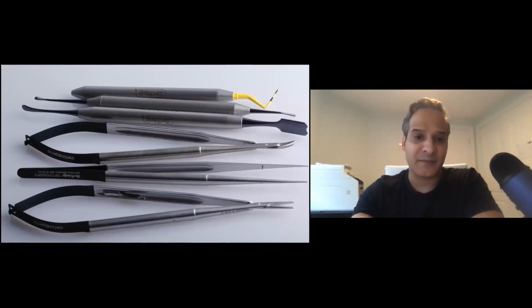If you have a chance, hold a Hu-Friedy brand needle holder that may be $300-400, and compare it to one of the $80 ones, and you'll see the difference. I am very picky with my instruments, so I don't look for value and savings when I'm buying them, because I know the cheaper instruments will make me waste more time when I'm actually working.